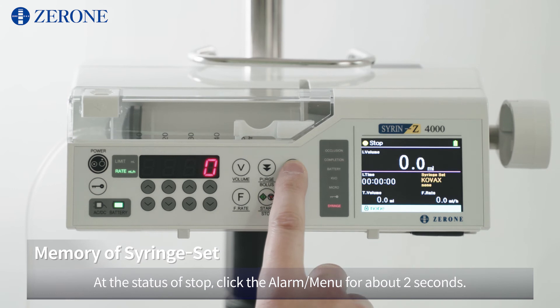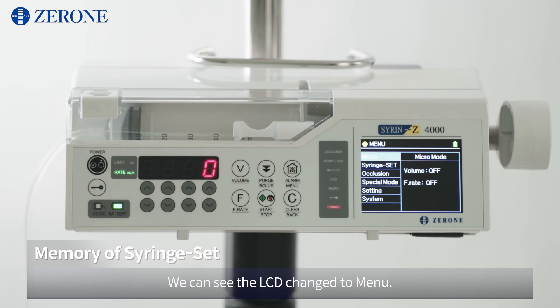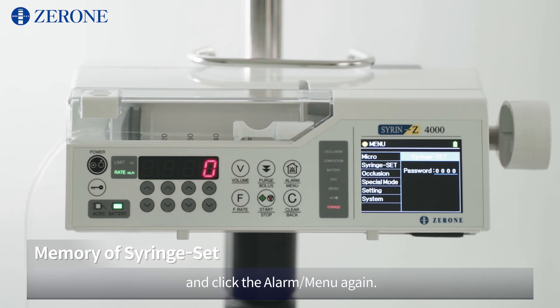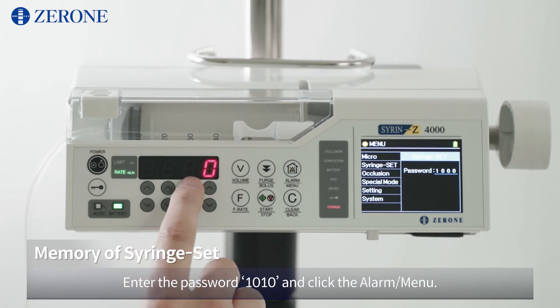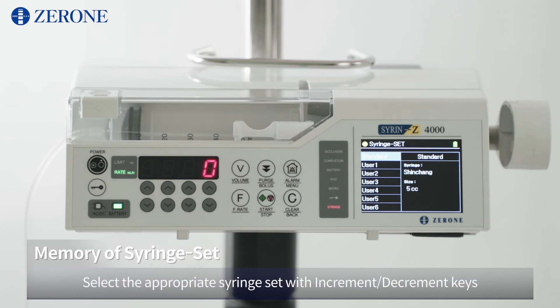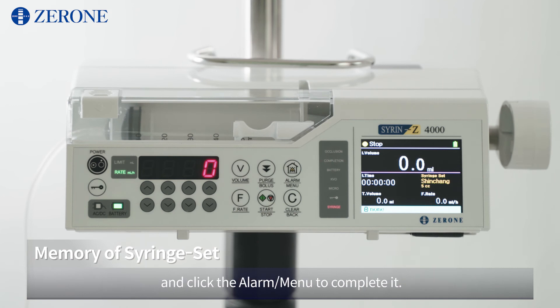At the status of stop, click the alarm menu for about 2 seconds. The LCD will change to the menu. Check the syringe set standard at the second line and click the alarm menu again. Enter the password 1010 and click the alarm menu. Check the standard and click the alarm menu. Select the appropriate syringe set with the increment and decrement keys and click the alarm menu to complete. Click Clear Back to return to home.